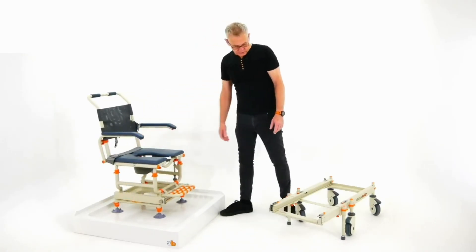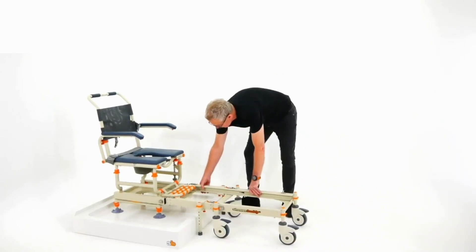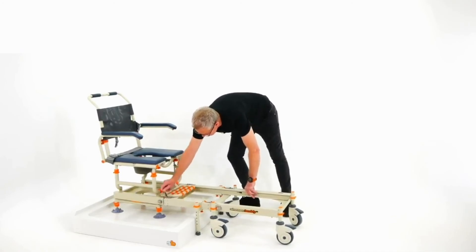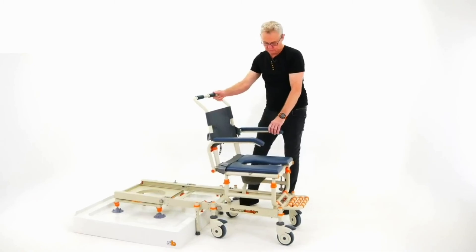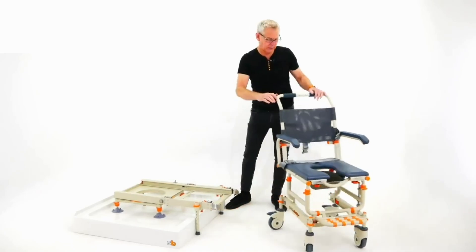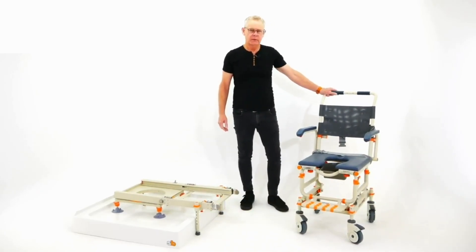So that's basically the ShowerBuddy. Once they've had their shower, just bring up the rolling base again, make the connection, disconnect from the bridge, and off we go. Thank you.